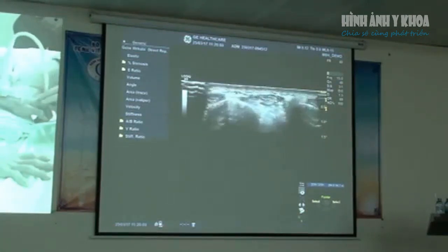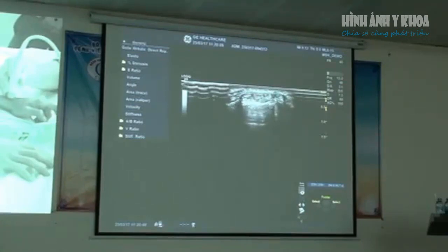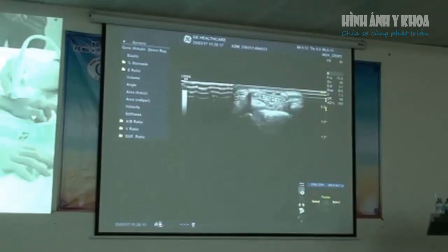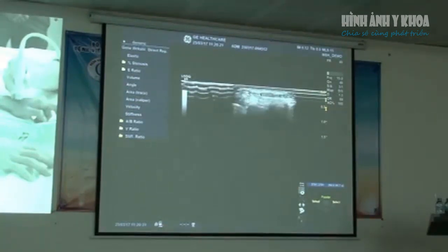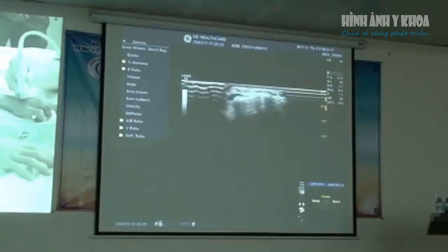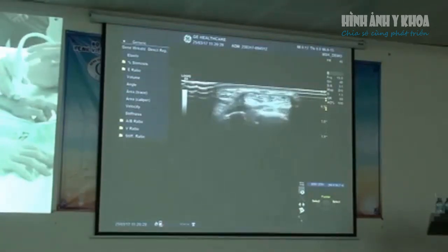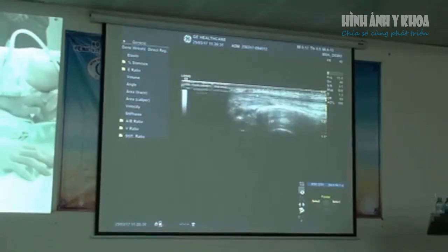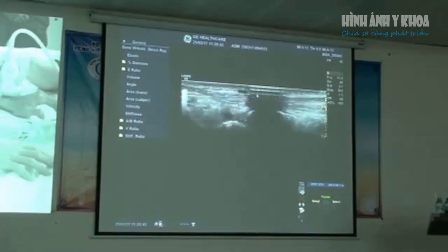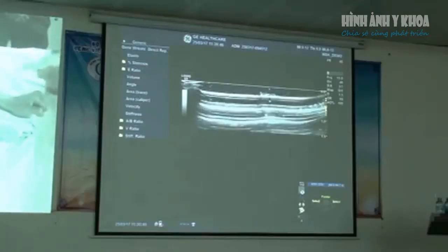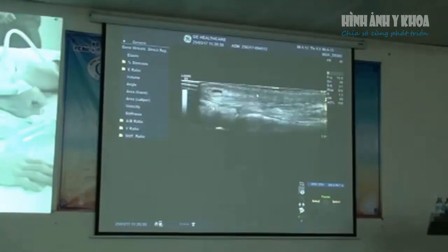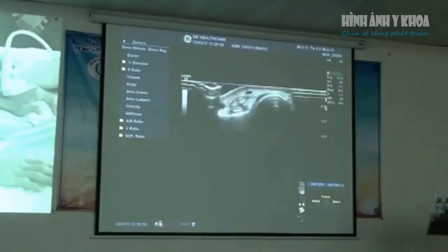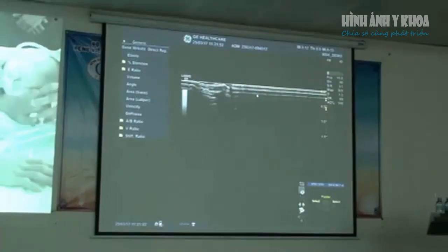If we come around a little bit more, we're now in compartment four. We've got the retinaculum going over the top. As we come more distally, you can see the individual tendon fibers starting to spray out to the fingers. We can turn transverse and wiggle the fingers just to make sure that everything is moving nice and smoothly.